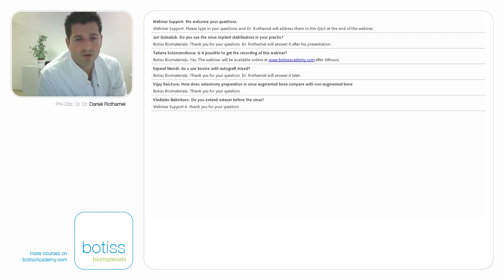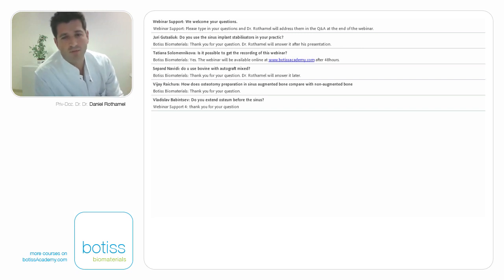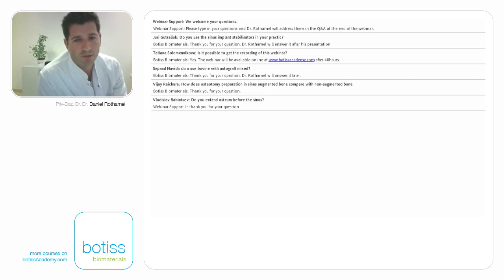Then, do you have any experience of mixing bone substitutes with autogenous platelet-derived factors, I think like PRF? A question by Alessandro Susino. We have performed a lot of cases with PRF. We have this PRF machine. I think it's supporting the application of the material, and also by application of the fibrin membrane, it might support the soft tissue healing as well.